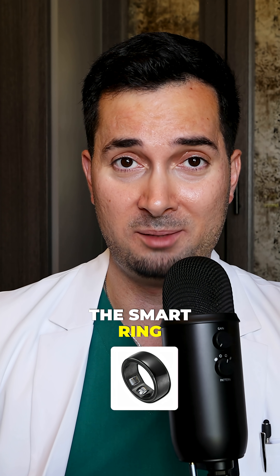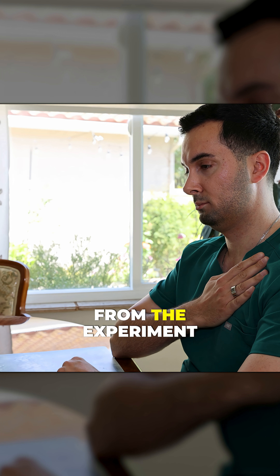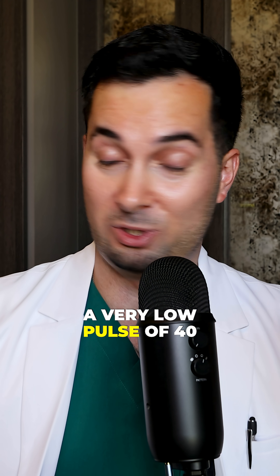The smart ring works with the same idea — it uses optical sensors. From the experiment you can see my blood pressure reading from the smart ring was 117 over 67, and a pulse of 40, which is a very low pulse.